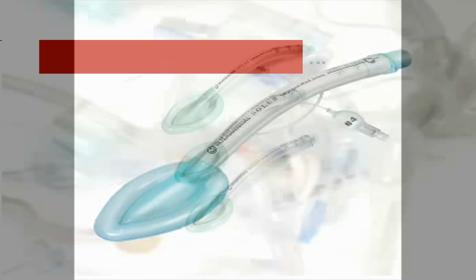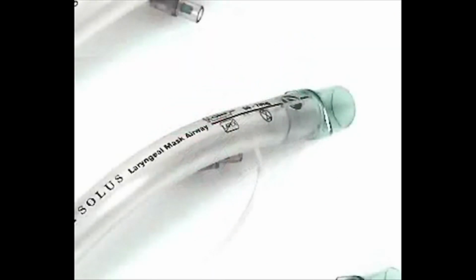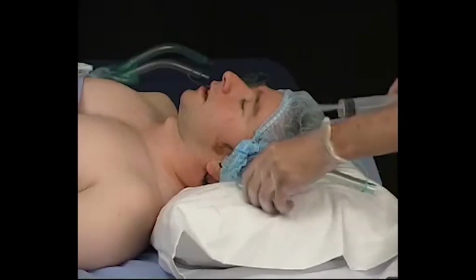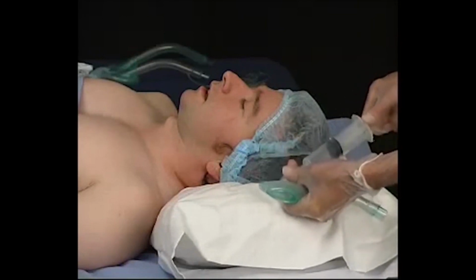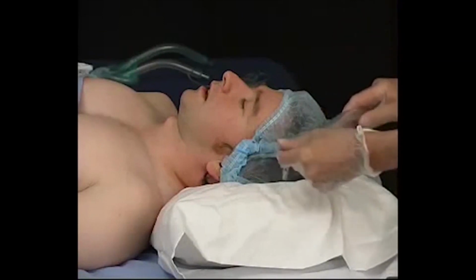What we're about to demonstrate is the correct insertion technique for the Intersurgical Solus laryngeal mask airway. Firstly, it is important that you select the correct size for each patient, and the patient weight does appear on the airway tube. Next, prepare the laryngeal mask airway by fully deflating it to a very tight vacuum. Contrary to some popular belief that there should be some air in the cuff, this is not so, because a filled cuff can collide with the epiglottis.